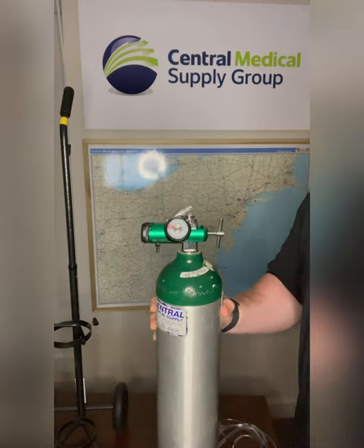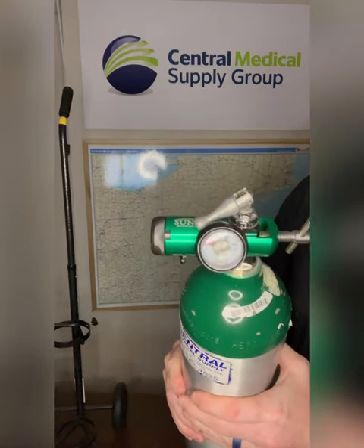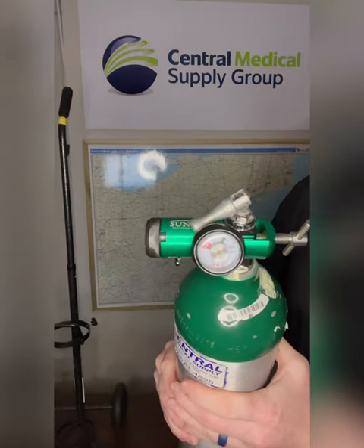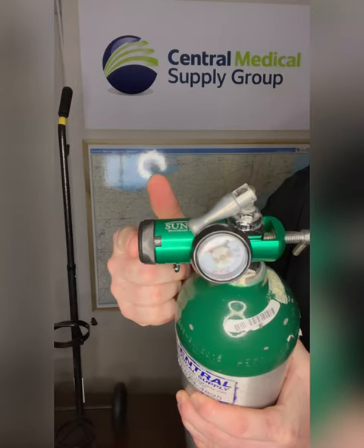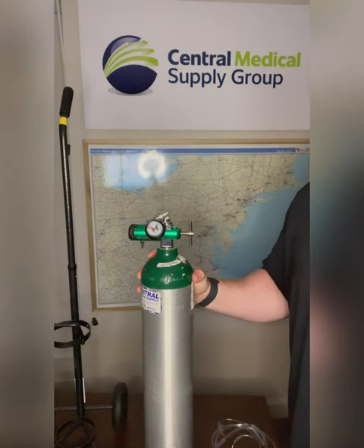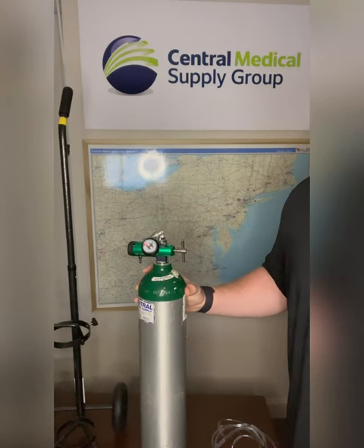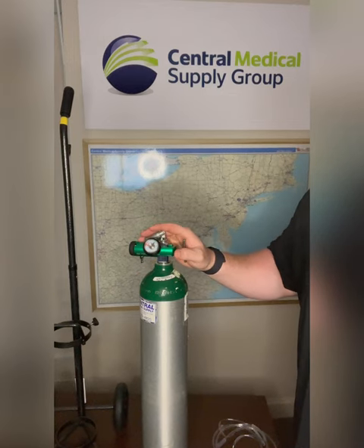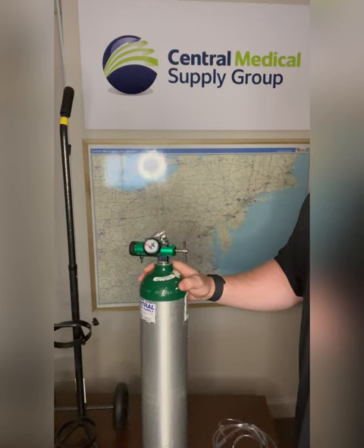Adjust the flow rate on the regulator according to the prescribed oxygen flow rate for the individual using the backup tank. This is where you will control your liter flow. Our technicians are instructed to match the regulator liters per minute to the concentrator's liter per minute per prescription orders upon delivery. The pressure and purity coming from the tank is much higher than the concentrator's, so the patient should notice an immediate difference.